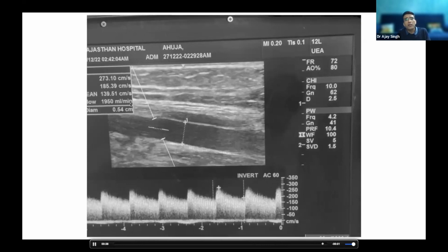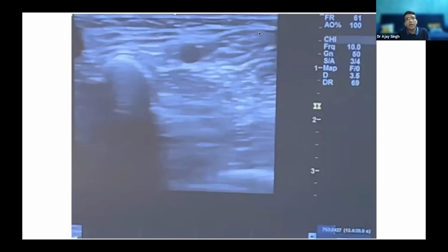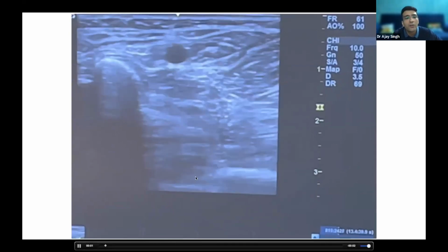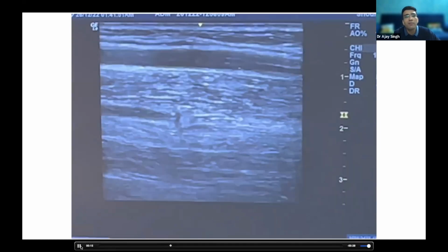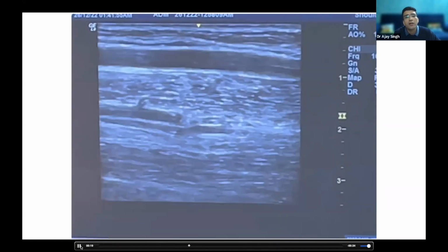Similarly, this is showing the same measurement in a radial artery. It can also be done in a radial artery, but it will many times underestimate the flow, because we know the flow in a radiocephalic fistula also comes from the ulnar artery through the palmar arch, backflow. So I'm just trying to focus the radial artery. Sometimes it can take some time.